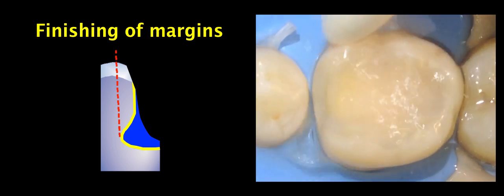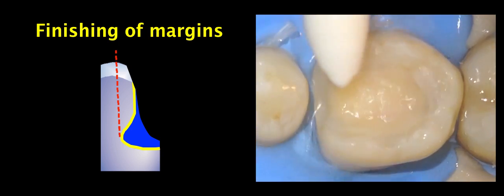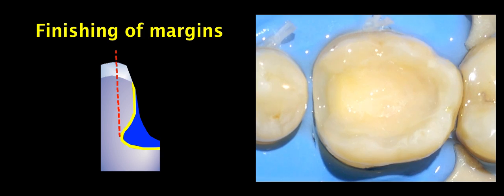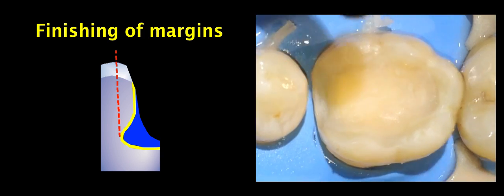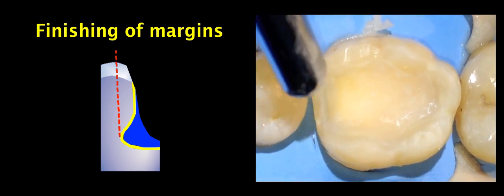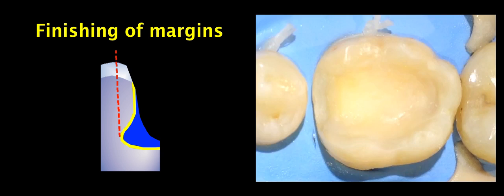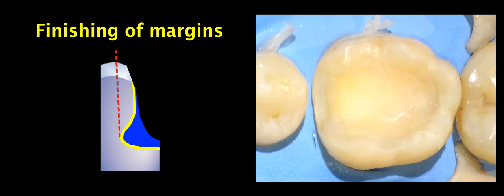Maybe this is due to the prosthodontic background but I personally prefer using the largest available diamond that can do my work and I like using round ended fine diamonds for this procedure. You must make sure that we don't have any remnants of the bonding or composite outside of the periphery of the margin. We can use discs in the proximal areas but it's nice to use also coarse instruments to finish our margins. As we can see here, silicone rubbers, it's better to use them with water so that we avoid overheating the margin and this is the last step of polishing the margin. We can see now that the margins are smooth and nice and we're ready to make our impression.